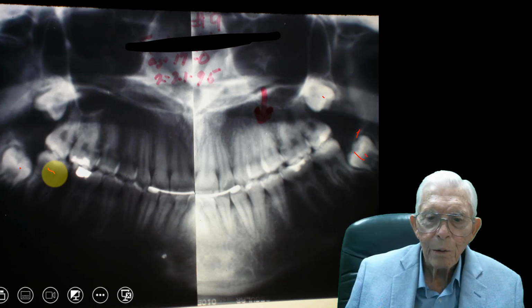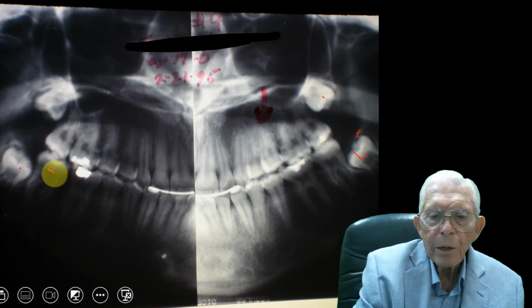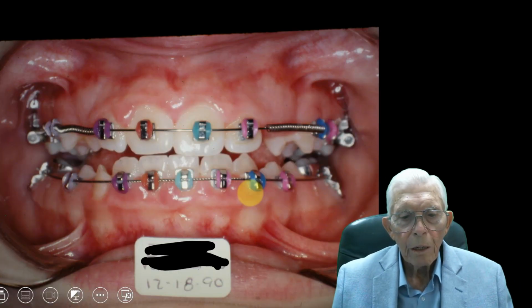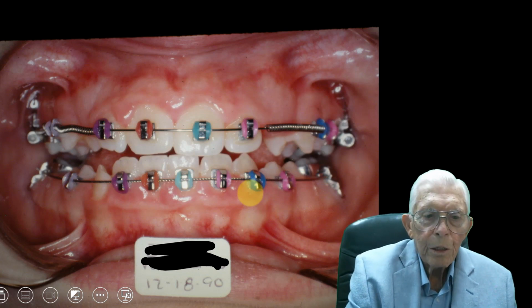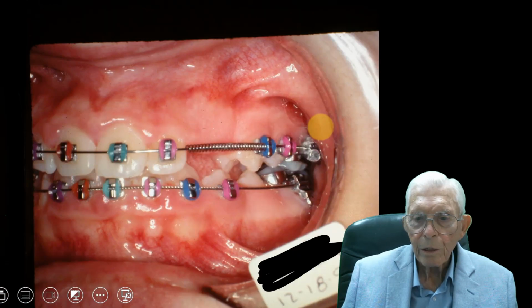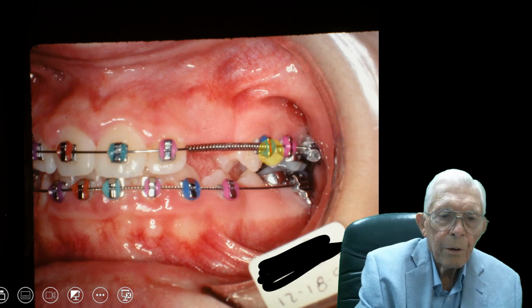So at this point, the teeth are all lined up in pretty good shape. We've got a 3 to 3 bonded on the bottom down here. Hold that in place. All right, now we go back to the pictures of the teeth. And this is where we're enlarging this with springs over there to line that up. And you'll see how that worked out. That's the way we did it. We used the little narrow brackets in here.